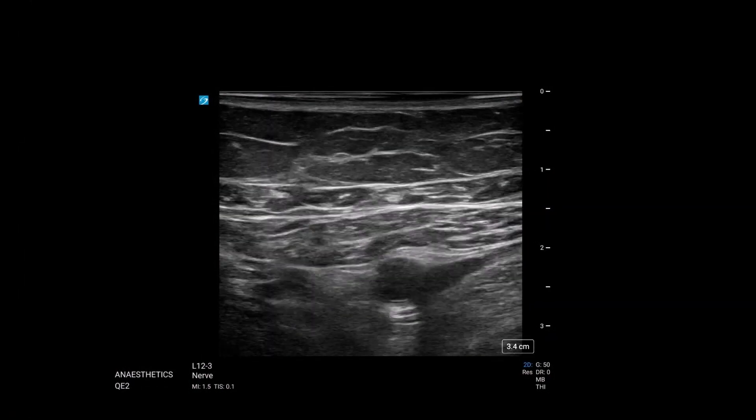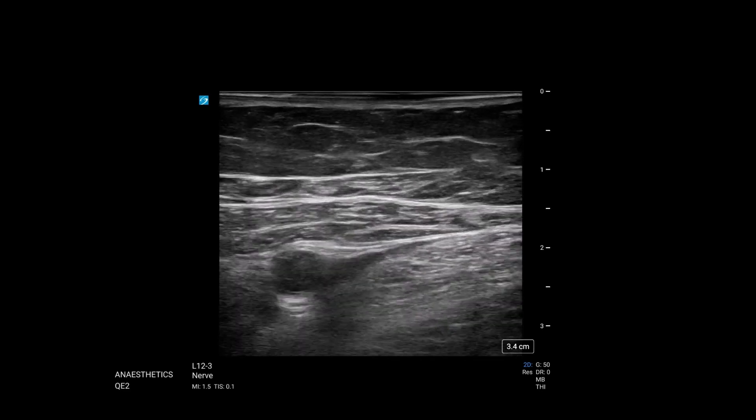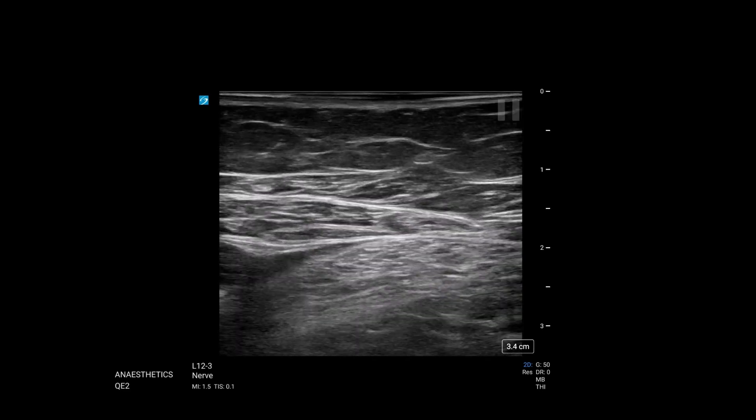So we start the scan, chuck the probe on. Now what we're going to do is move the probe away from us. As we do that, we shift the artery off screen — we don't really care about that anymore — and we're looking medially. This is the medial aspect of the leg. Remember, the medial aspect of the leg is where the adductors are, and that's what we're interested in. We want to find where the junction between sartorius and the adductor longus is.